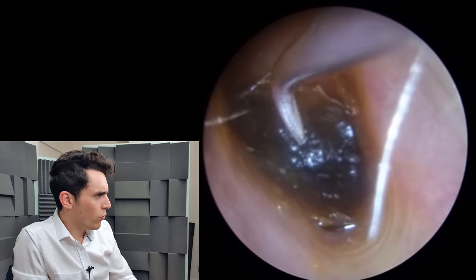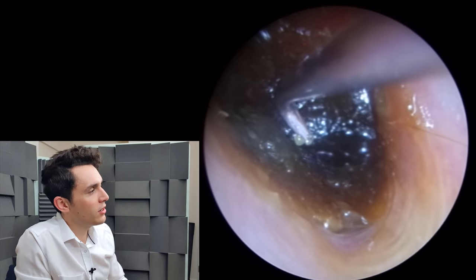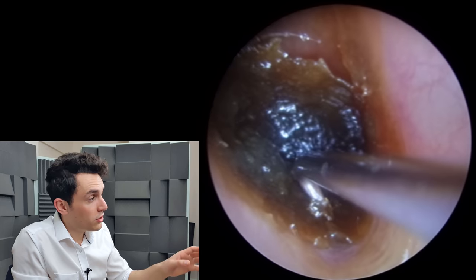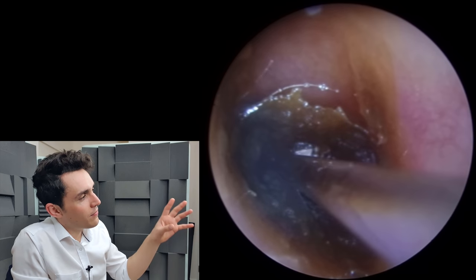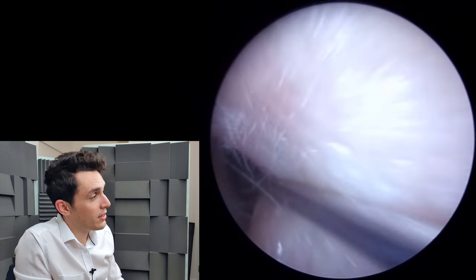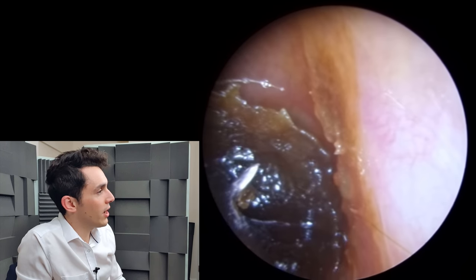So I'm going in here with a Cawthorn hook. I'm not really looking to remove the debris with it, but just to move it around and disturb it. It looks as though I'm not doing much, but I am in fact just disturbing the debris and loosening it up a little bit. Working this close to the eardrum, this deep in the ear with any kind of manual tool comes with its risks, which is why I'm being so careful.